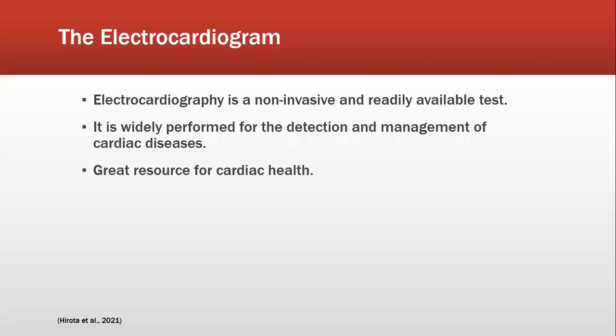So electrocardiography is a very non-invasive and readily available test. They're available everywhere in any kind of medical facility you go to. There's a good chance that you're going to have one of these machines. They're used to detect and help prevent cardiac issues, as well as monitor basic heart function of an individual. It's a great resource for heart health management.